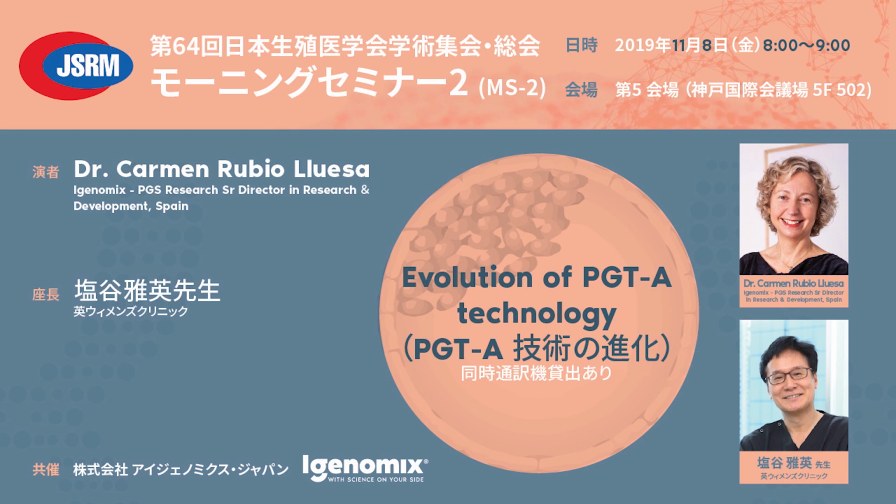Okay, we have done the study of embryo quality comparing with the results of concordance, and with the first 100 embryos, we didn't observe any relation with embryo quality. At that point in this study, our colleagues in Italy were also recording if there were cells extruded that were not compacting and forming the blastocyst. So you also have external cells in the perivitelline space. And also in this first study, we were measuring the thickness of the zona pellucida and of the perivitelline space. We didn't find anything related to the aneuploidy or the concordance.